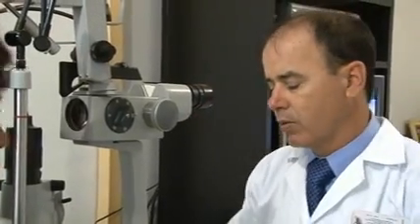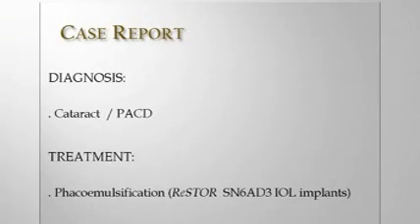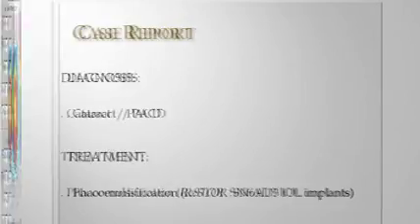On a routine ophthalmic consultation, a 63-year-old woman complained of slowly progressive blurred vision and also some perception of halos and glare for both eyes. At slit lamp examination, both eyes showed increased corneal mid-stromal refringence, narrow anterior chamber angle, and nuclear sclerosis. No other abnormalities were detected. Cataract and posterior amorphous corneal dystrophy (PACD) were diagnosed.